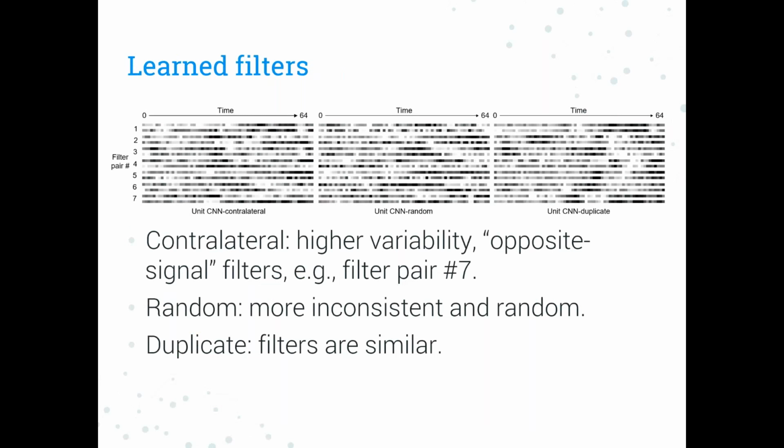So it does appear that having that control comparison helps to predict whether or not a voxel will die. And these are the filters we learned, so we can look at the first layer of the network and see what the filters look like. So these are the pairs of filters, just 7 of our 25 examples. I think we have more than that, but these are just 7 that we cherry-picked.